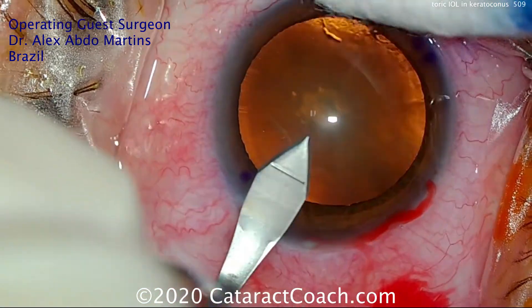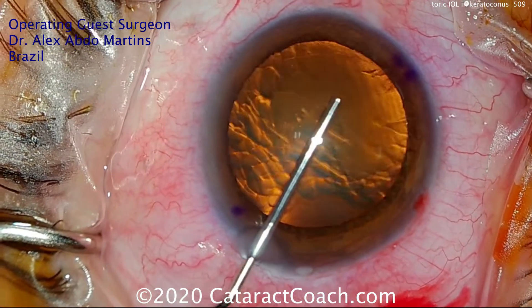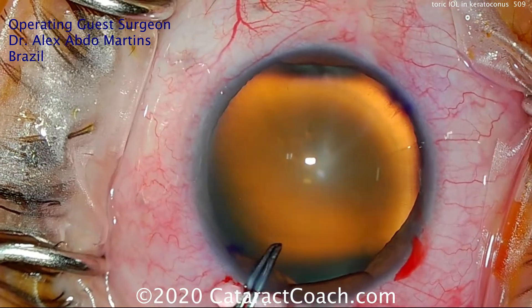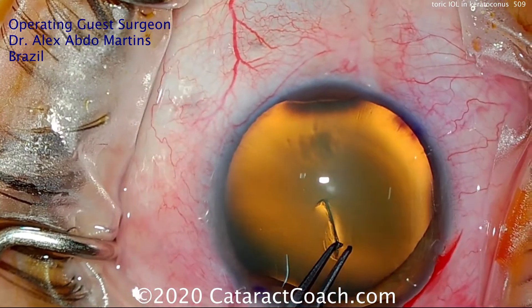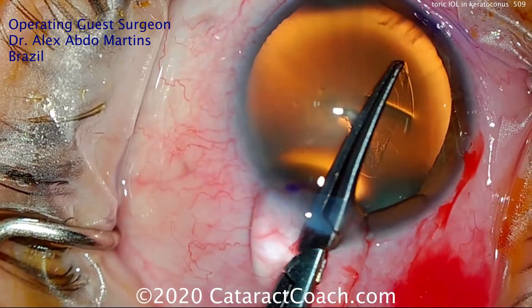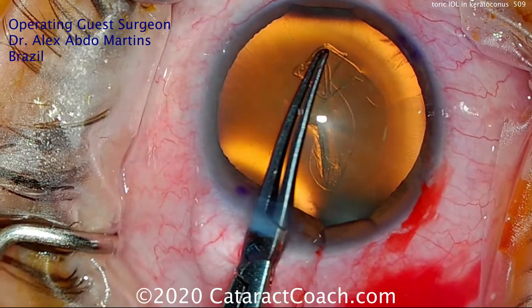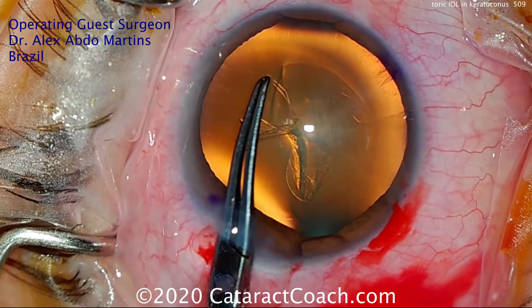The main incision is being made here — it's pretty close to the steep axis. Don't make the incision too far away from the steep axis, because it may change the orientation of the astigmatism to some degree. You want to keep everything close to that same meridian. For a Toric lens, you want a nice capsulorrhexis that's going to overlap your optic for 360 degrees, for extra stability.